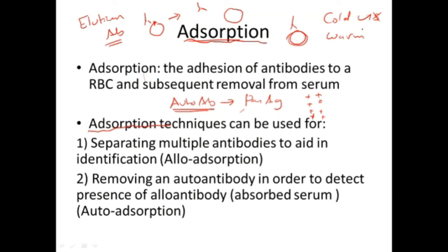So it's not like a cold, we can just come around it. Here it's quite hard to deal with people with autoantibody. So this is one way to solve the problem with these people. طيب، قلنا احنا دائما بترجع ان شاء الله. احنا قلنا دائما we are usually afraid of a allo antibody or autoantibody.